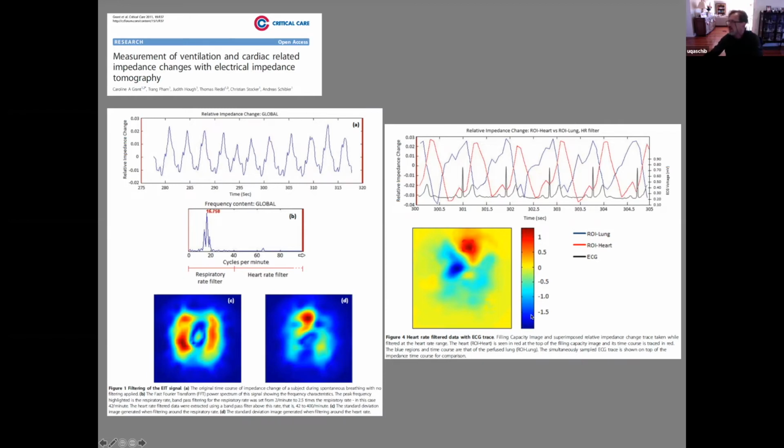So we have a phase difference where the heart is pumping and then distributing with a phase lag into the lung, and that's what we expect, that the phase of the heart contraction is not completely in phase with the blood volume distribution within the lung. So by using EIT and ECG gating, we can even analyze the perfusion and the time sequence of volume distribution within the chest.